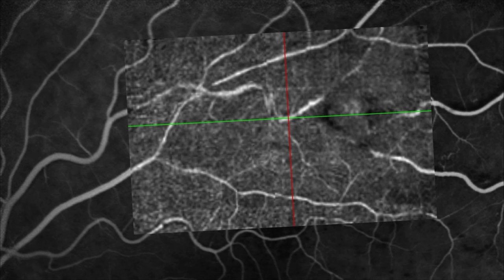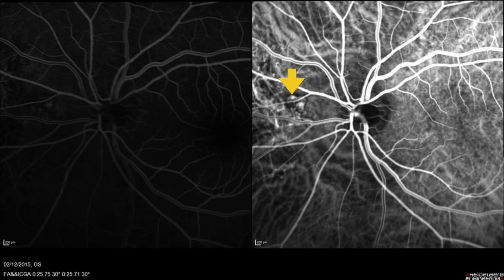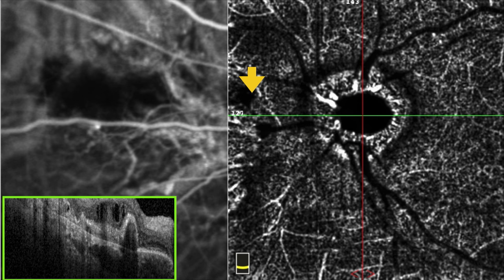What about choroidal vascularization? We know about polypoidal lesions and slow filling - here you see the polyp filling very slowly. If we explode the image, here is the polyp. If you overlap with the angio-OCT, you don't see anything. Too slow - not visible.